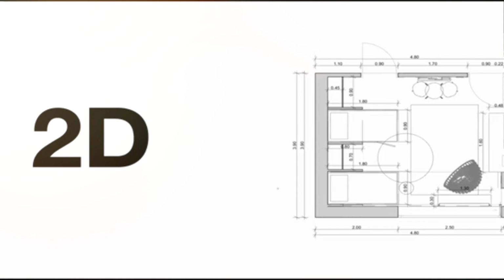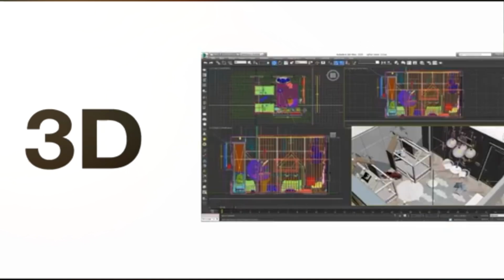And if you want to think about it, every 3D file we see in dental, we see it on a computer screen, which is also 2D. So it's a bit different what we do, because we interpret 3D information in 2D images. So after you have the 2D plan in architecture, then you have to scale it to 3D. So you first fix 2 axes out of 3, then you scale it up.